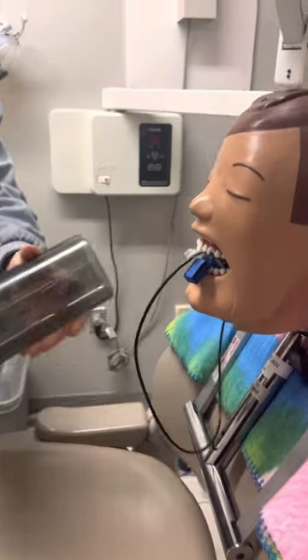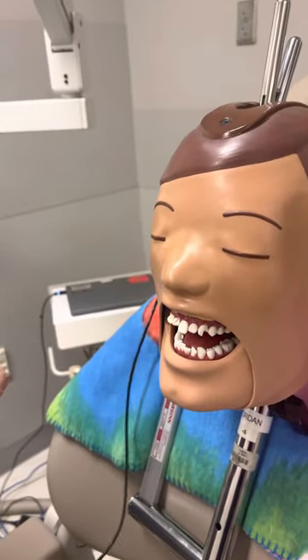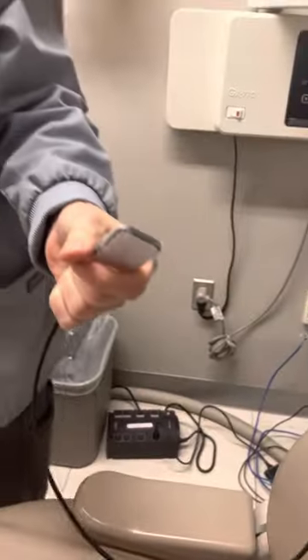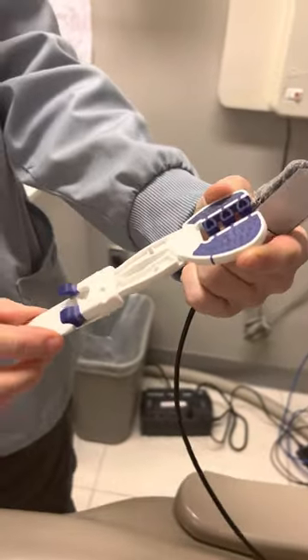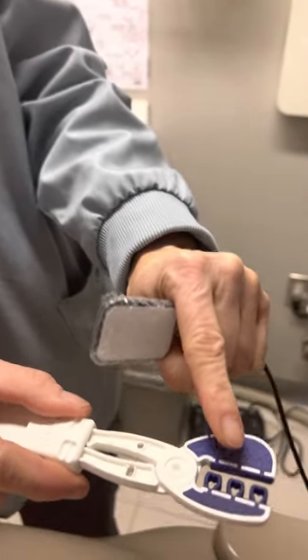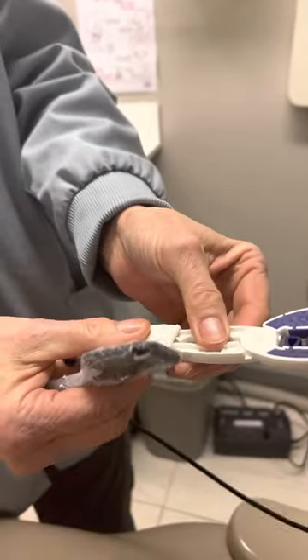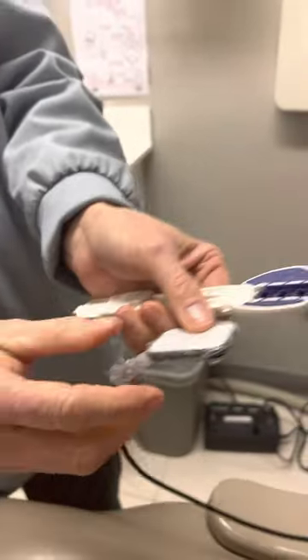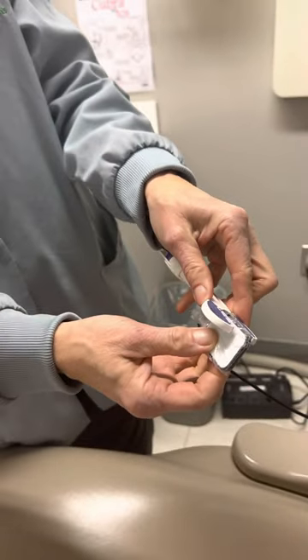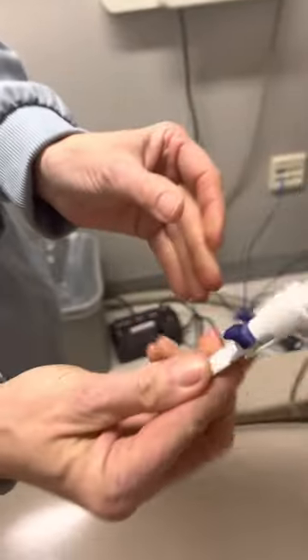Now we're going to move to posterior. Your anteriors are just with the bite block — no holders. There are various different types of bite blocks you can use. Now we're going to use the snap array. The bigger end of the snap array is always going to face outside, towards you, when you're loading. The arm goes outside of the patient's mouth and the cord follows the arm. Put it right inside at the end, scrunch those down, and then slide that little lever up.